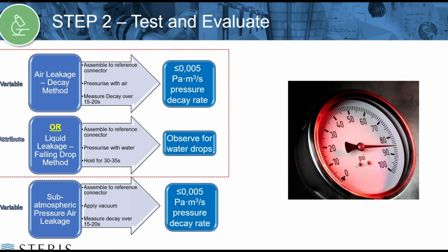We use a test rig shown here on the left. And this test rig has a series of weights that can be used and a torque sensor located on the top. The reference gauge is inserted into the jig, and the test technician assembles the Luer fitting into the connector while applying a torque and an axial load.